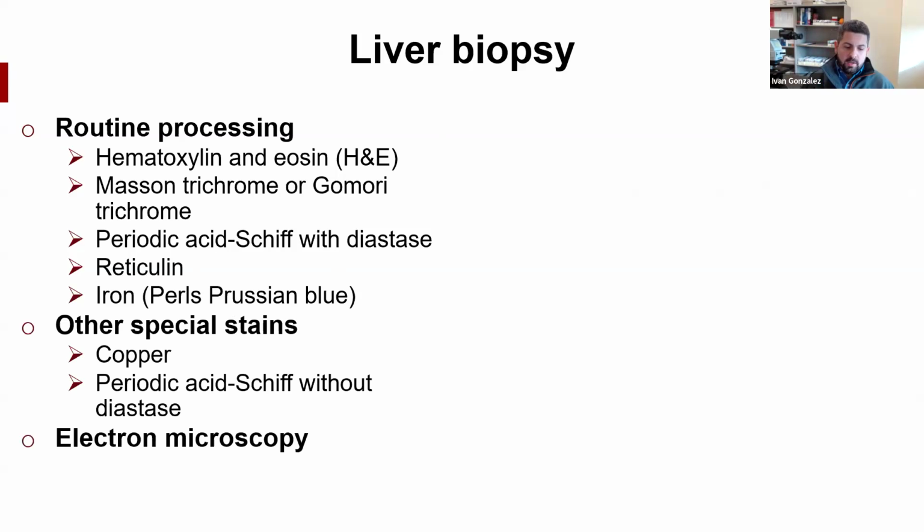We also get from the clinician one sample that is dedicated for electron microscopy. So we'll basically get 2 containers, one with 1 or 2 long cores of liver biopsy, and then another one with a small fragment of liver that will be for electron microscopy. We process it, we just don't take the photos of the EM right away. We only take the photos if, based on the histology, we think we need it, or the clinician specifically requested to run the EM. But we already have it processed in case we need it in the future.